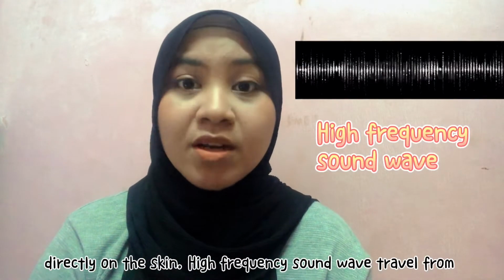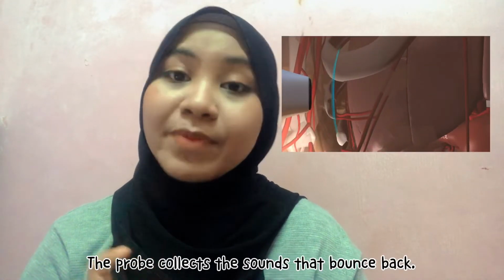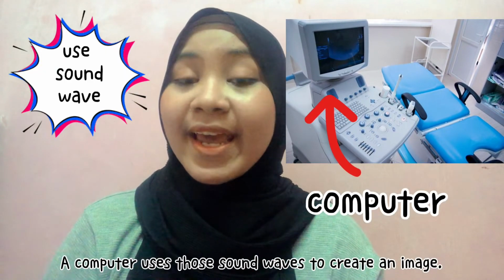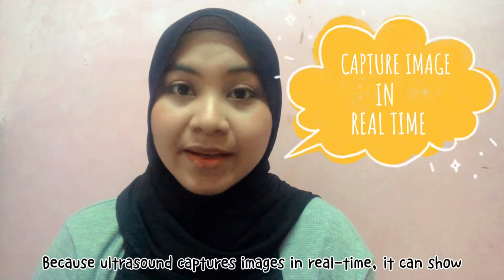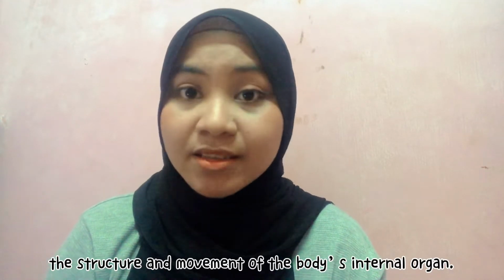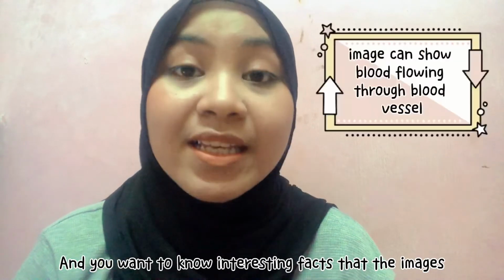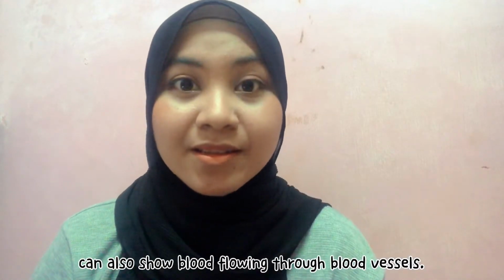High-frequency sound waves travel from the probe through the gel into the body. The probe collects the sounds that bounce back. A computer uses the sound waves to create an image. Because ultrasound captures images in real time, it can show the structure and the movement of the body's internal organs. And you want to know an interesting fact? The image can also show the blood flowing through the blood vessels. It's quite interesting, right?